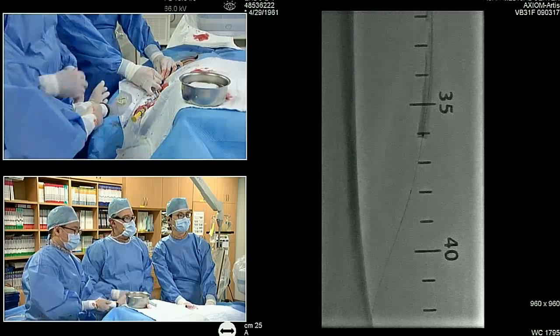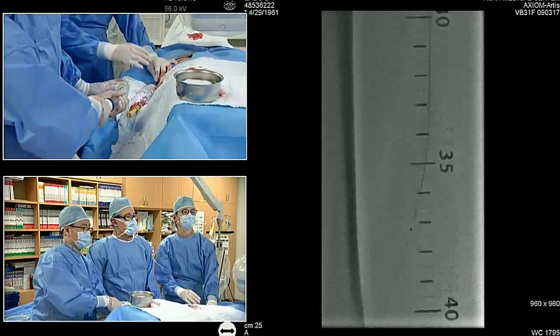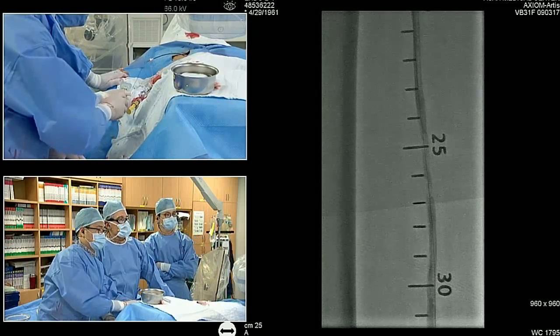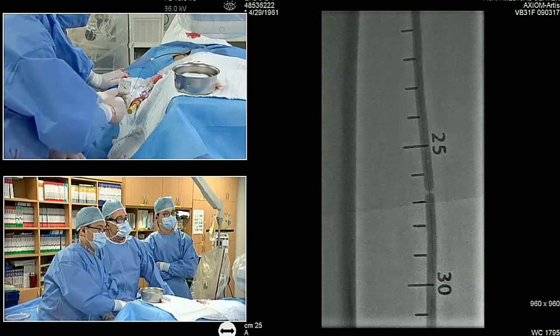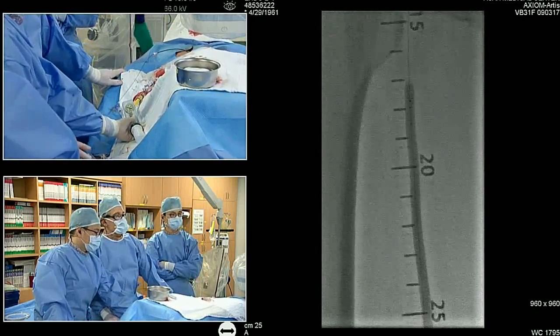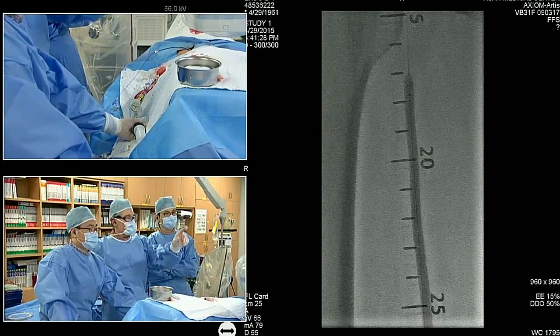Yeah, a little further. Okay. All right, let's go again. Go gradual. Interesting how the wrap, there it goes. Okay. All right, that's good. Store monitor that. And then we'll do one more inflation at the origin.